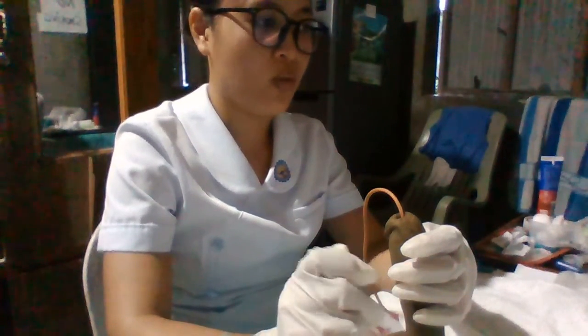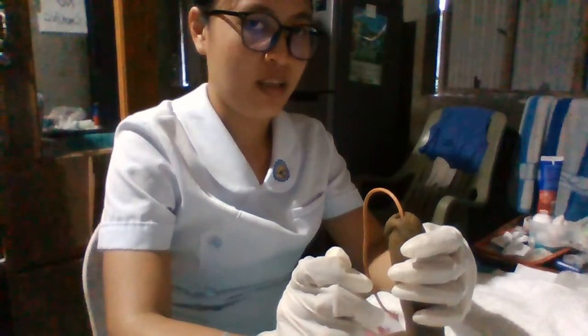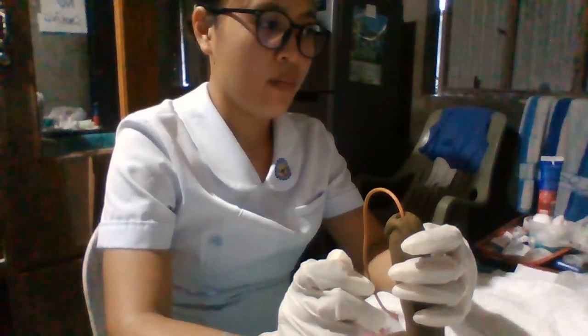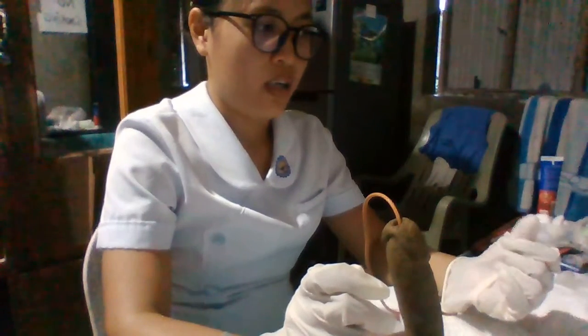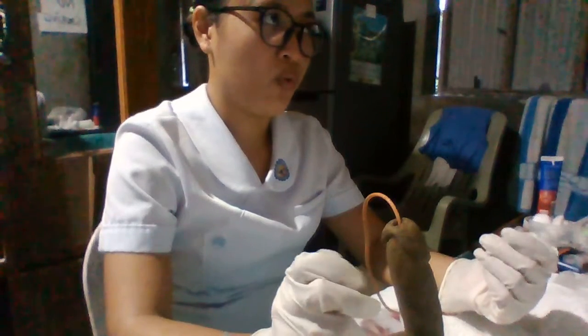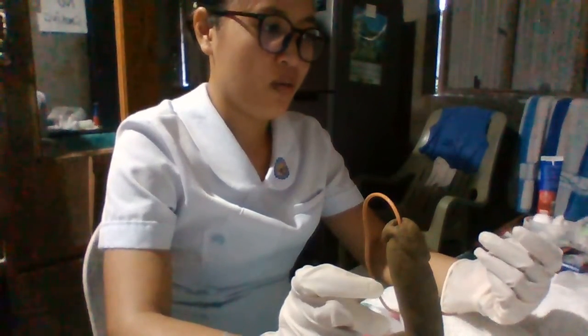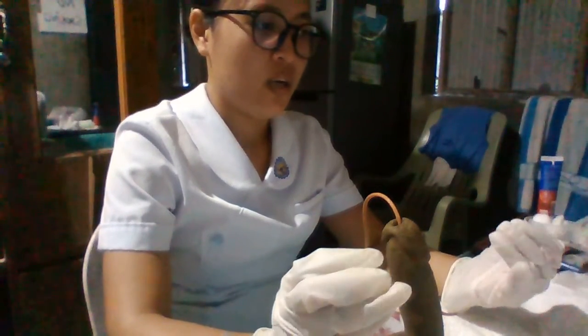Then afterwards, we are going to cleanse the perineal area. For a female, we are going to separate the cotton balls and forceps, then cleanse the labia majora, moving down towards the anus, and afterwards repeat the process to cleanse each side.